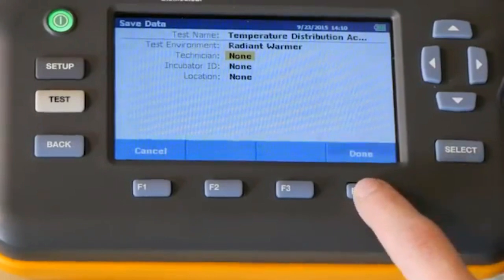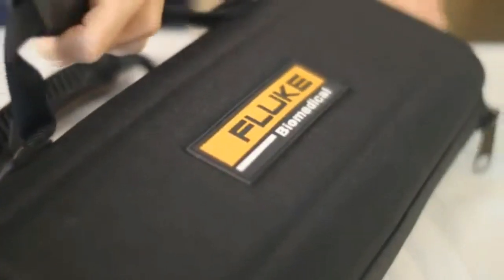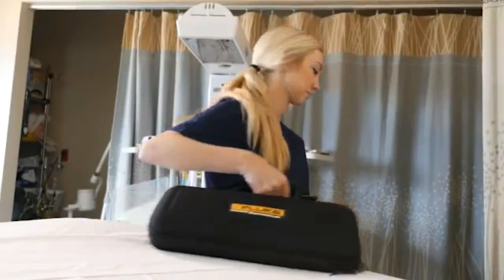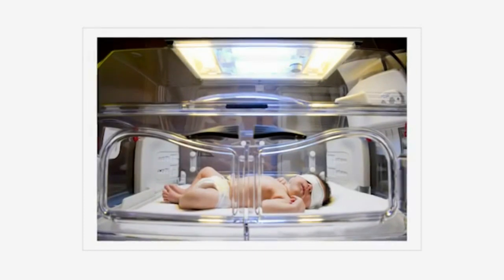Using its wireless functionality, test data can be sent and monitored from your computer, further increasing efficiency. Equally important, the Inq2 complies with the largest global industry standards.